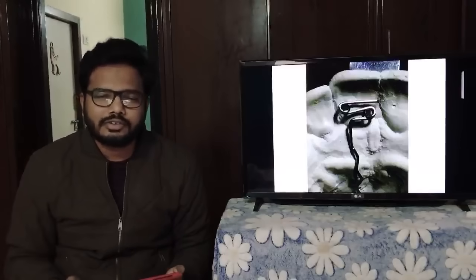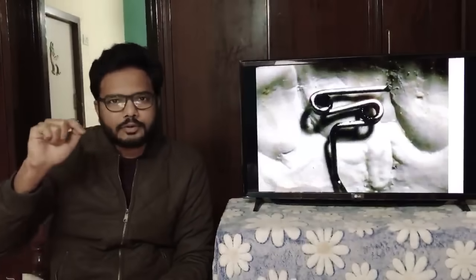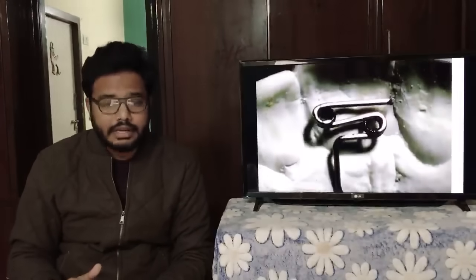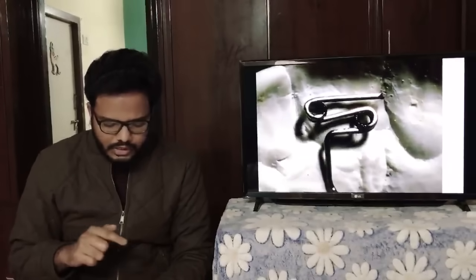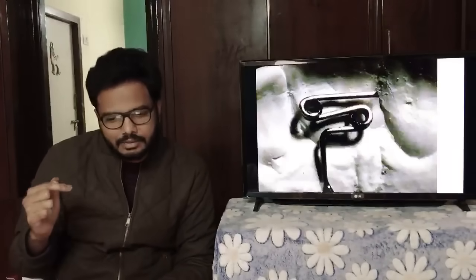Identify the appliance. You might have done plenty of these appliances during your undergraduation. Identify the appliance. There seem to be two coils, and it seems to have an arm which is around 10 to 12 millimeters in length. And these coils are in fact cantilever. It's a double cantilever spring. It's also called a double cantilever spring.